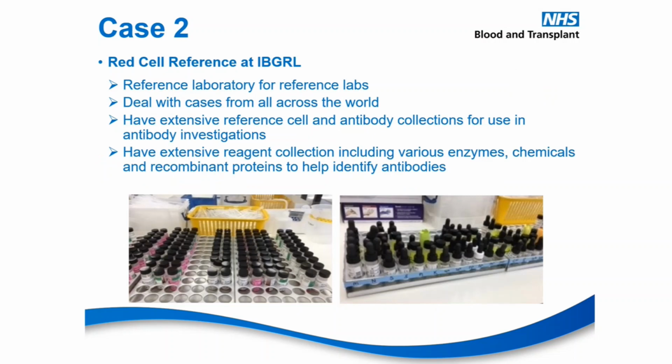IBGRL is the International Blood Group Reference Laboratory. They are the reference lab for reference labs. They deal with cases from all across the world. They are the people that take on the investigations where we can't work out what the antibodies are. They have an extensive reference cell and antibody collection for use in antibody investigations. And they have an extensive reagent collection that includes enzymes, chemicals, and recombinant proteins to help identify antibodies.